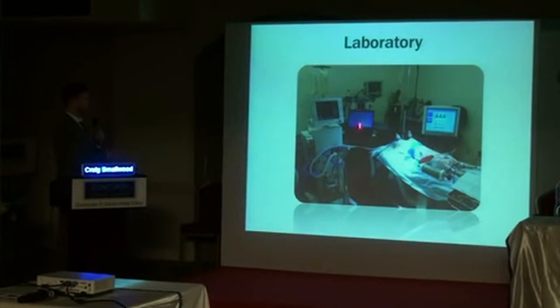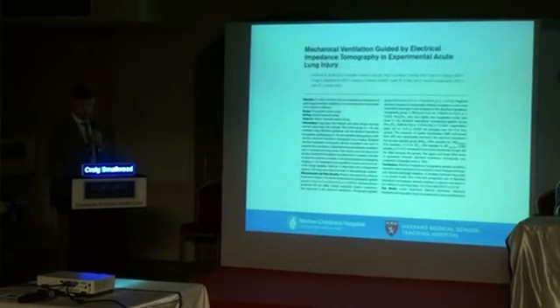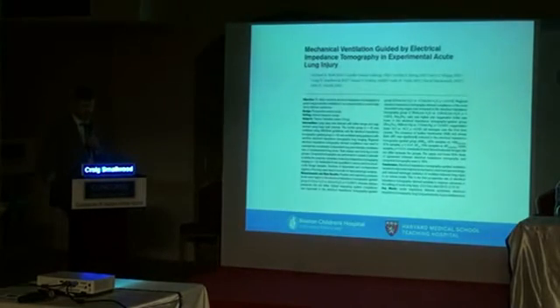We also collected some other measurements which are not necessarily important, but we had the conventional ventilator here. We measured gas exchange. We talked about VO2 and VCO2 a little bit yesterday. We collected all that information as well, and then obviously monitored lung mechanics. And you can see here the band is wrapped around the thorax of the piglet. So this is, I think, a really cool study.